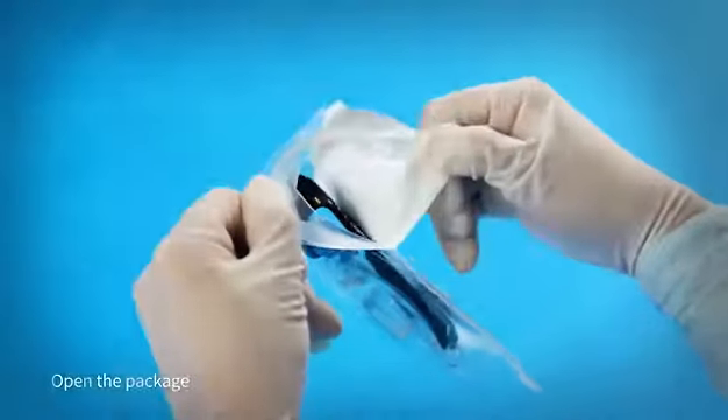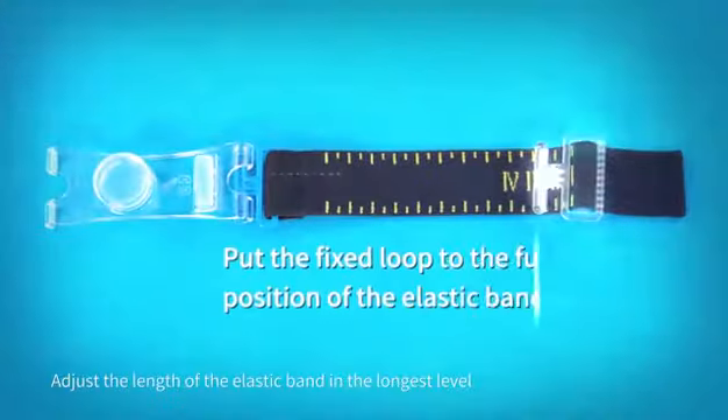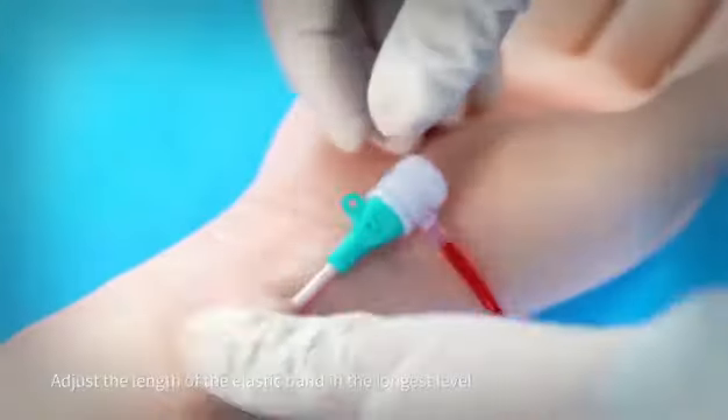Open the package. Unfold the Velcro strap to avoid it sticking too tight. Adjust the length of the elastic band to the longest level.